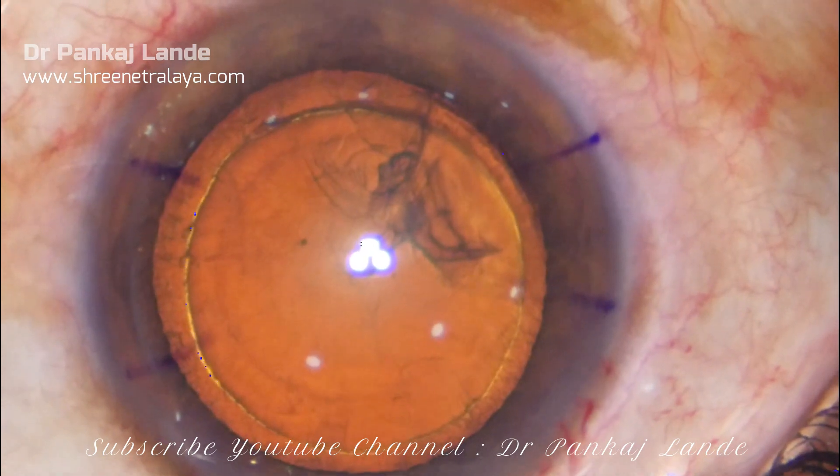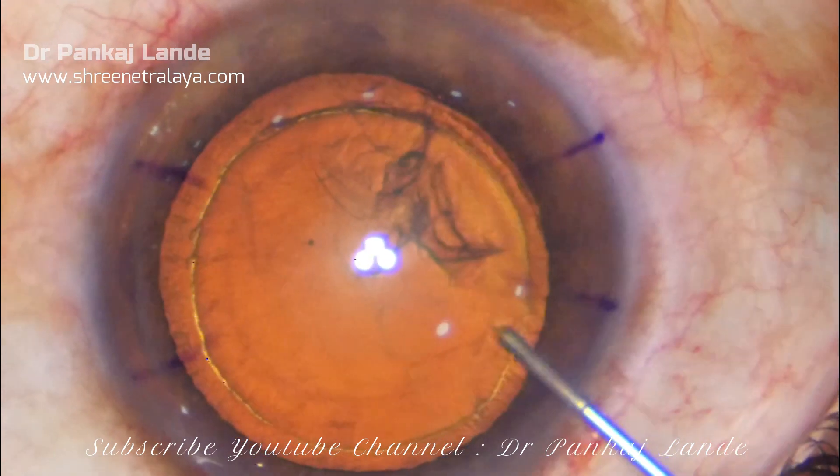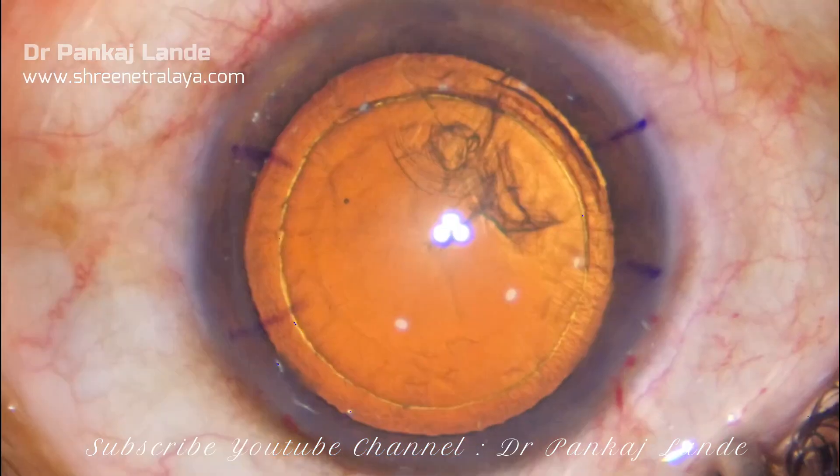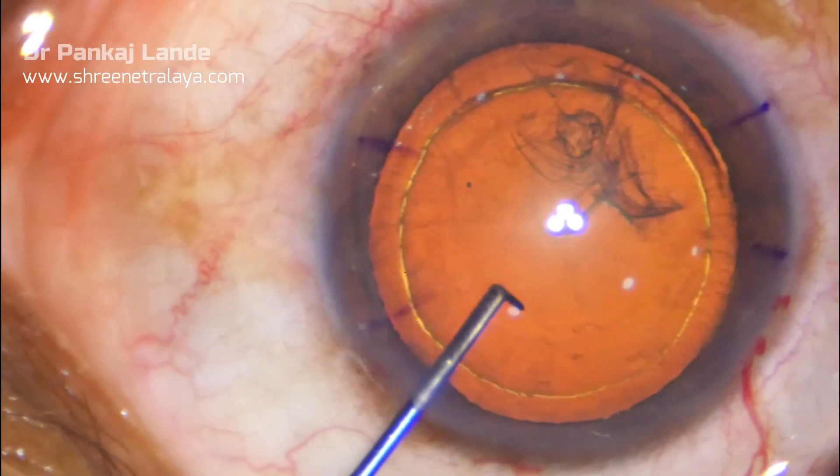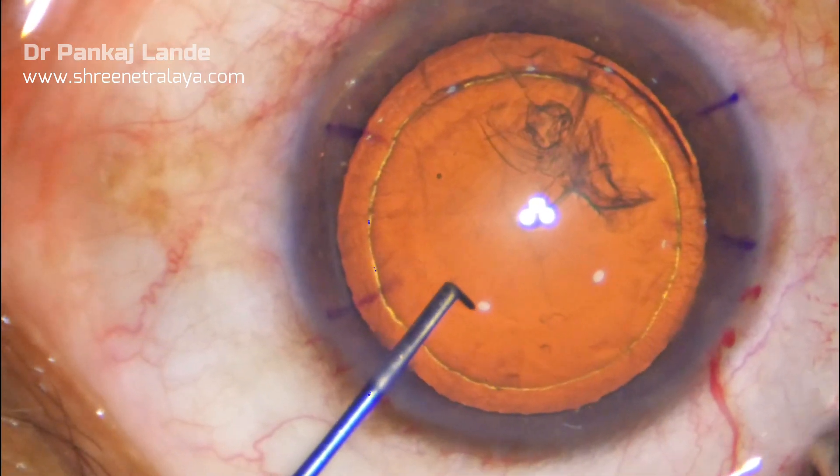It is a soft cataract. Once I enter into the anterior chamber, I will debulk the bag by removing the cortical material so that I can get more space for maneuverability.